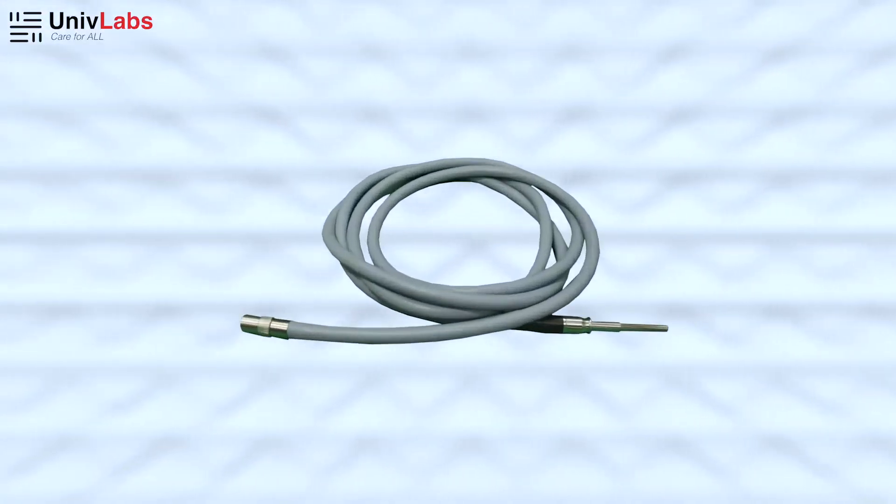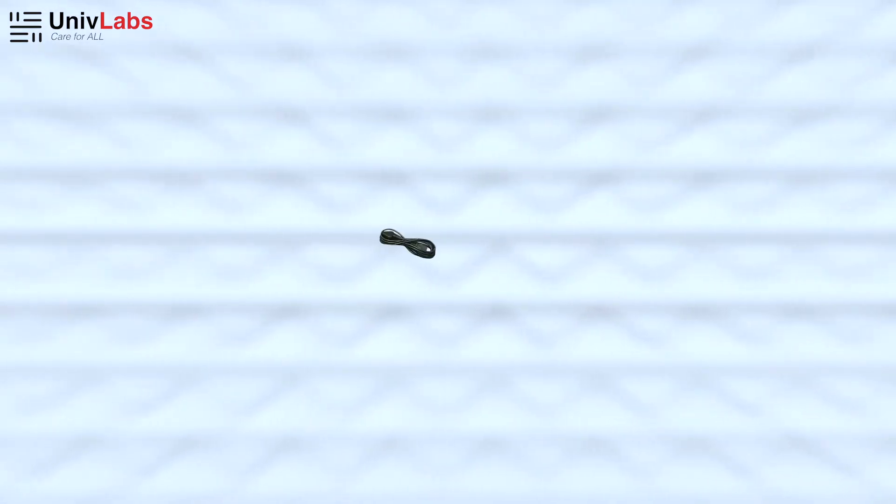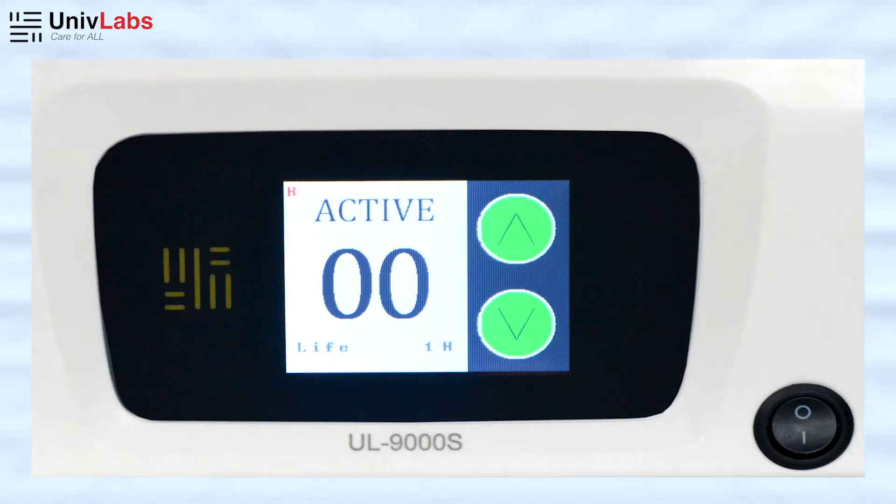The unit comes with an optical fiber cable connected at the front end and a power cord connected at the rear end. It has a touch screen control and a lifetime warranty for the LED.